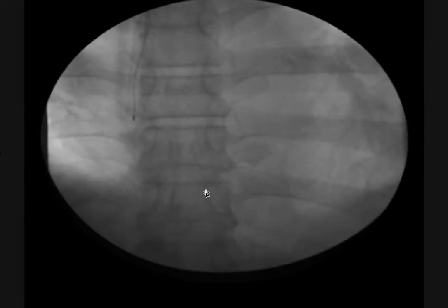I don't advocate using femoral extraction exclusively. I think that it's tremendously helpful when used in conjunction with prepectoral extraction with powered sheaths. You could put a nice tension on the lead and makes it easier to track down the lead from above, depending on how old the leads are, how much calcification there is.